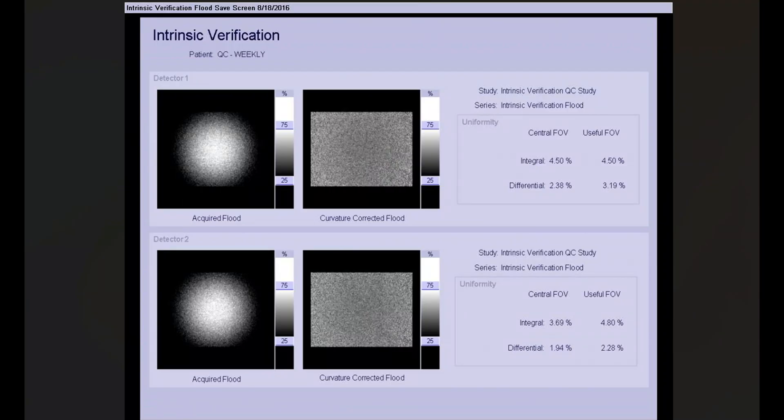Whenever we're doing our flood images, we need to make sure we're looking at the intrinsic criteria for intrinsic floods and the extrinsic criteria for extrinsic floods. Again, these are for 10 million count floods and apply to the intrinsic or extrinsic verification — not the calibration. The calibration criteria are different, in the 7 to 10 percent range, and we'll cover that shortly. Now let's look at some actual images. Here we have an intrinsic verification from a Siemens Symbia.